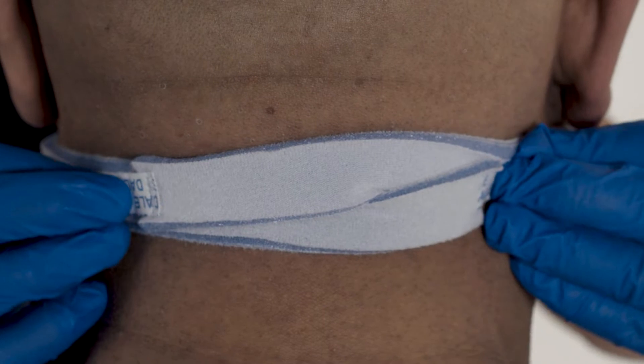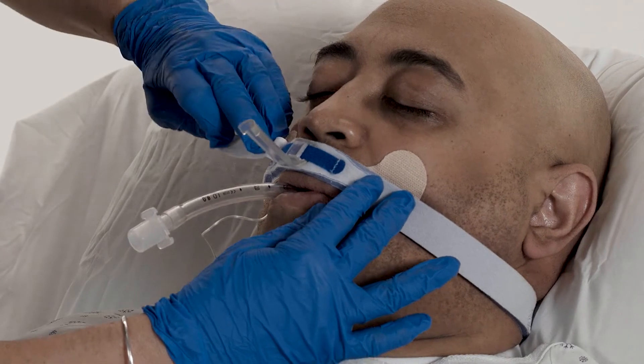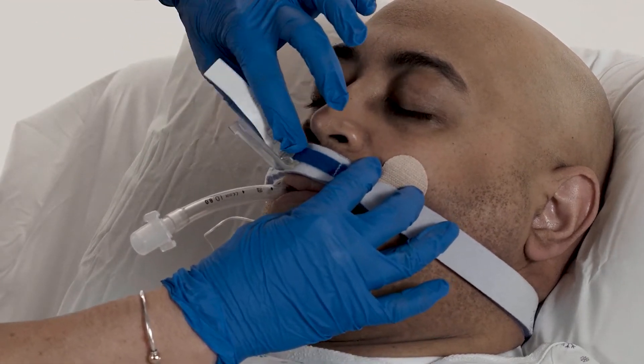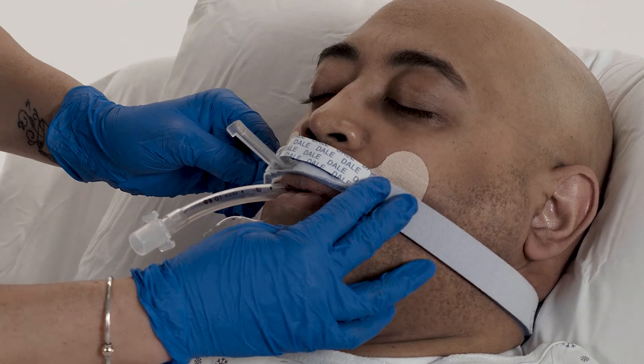Press the closures to the outside of the band to secure. Lift the Dale Overlay and position the channel over the ET tube. Press the Dale Overlay across the track and neckband to secure the position of the endotracheal tube.